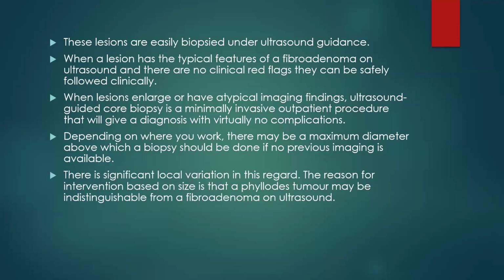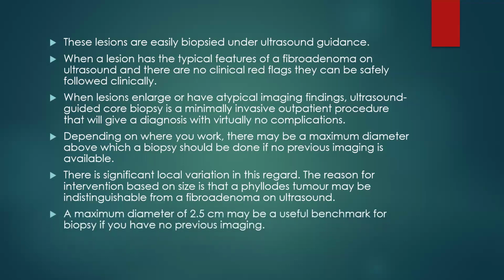The reason for intervention based on size is that a phyllodes tumor is indistinguishable from fibroadenoma on ultrasound, and it could be from the malignant subtype, for example. A maximum diameter of 2.5 centimeters may be a useful benchmark for biopsy if you have no previous imaging to compare with. Interval enlargement is an indication for biopsy.